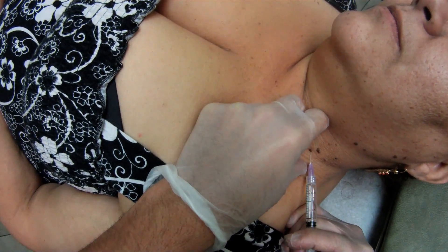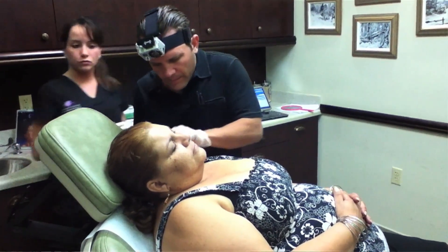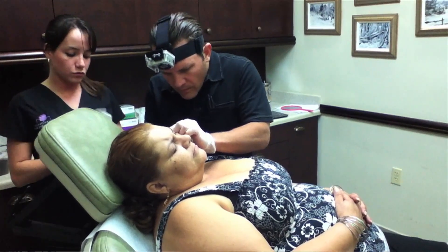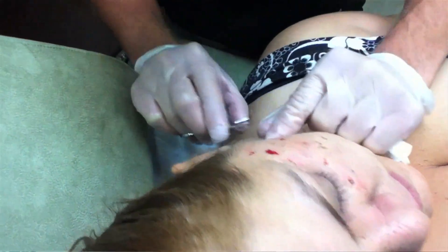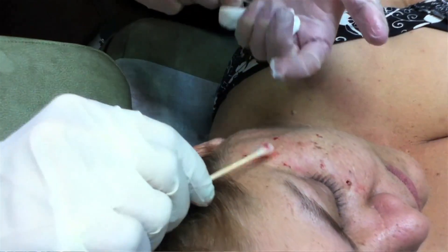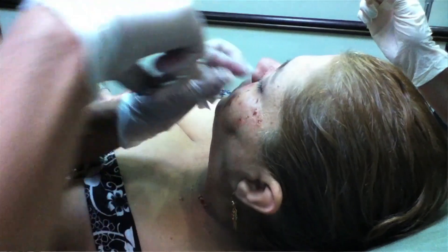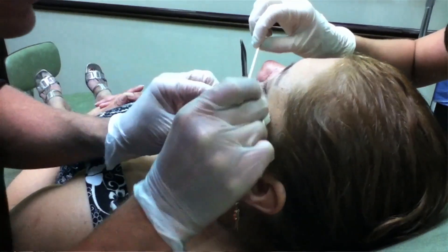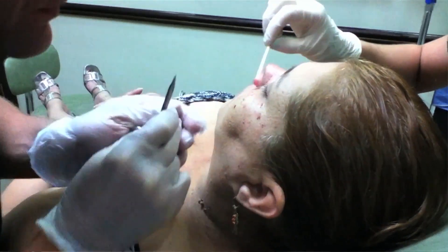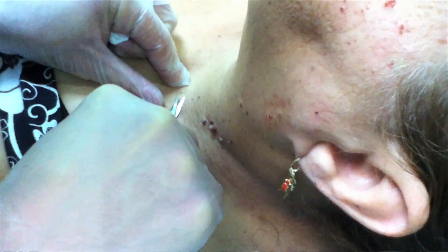A little pinch, a little burn. Let's start snipping a little bit. I'm just going to go around. We can put a little aluminum chloride on those. Getting some of these bigger ones off. And then I'm going to jump around with a little electric needle to zap it so hopefully they won't come back in the future.